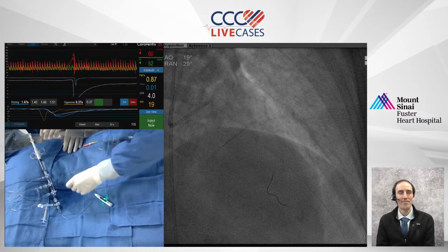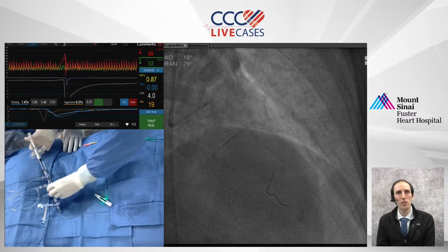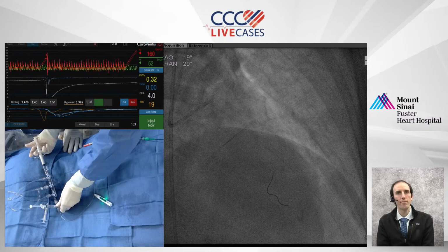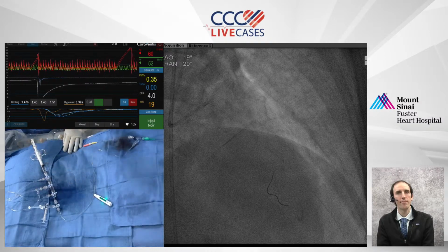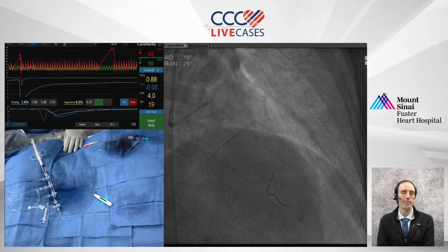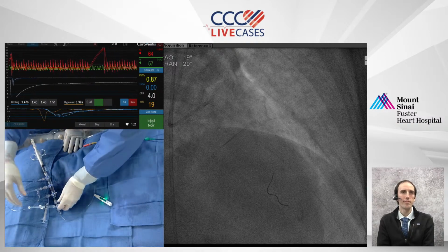I have a few too. So how long do you wait to achieve hyperemia? At least, once I see the signs, I'll do it right away. I don't have to wait a specific time. If I don't see hyperemia, then I'll wait 2 minutes. Sometimes we do a higher dose, but she's clearly hyperemic here.